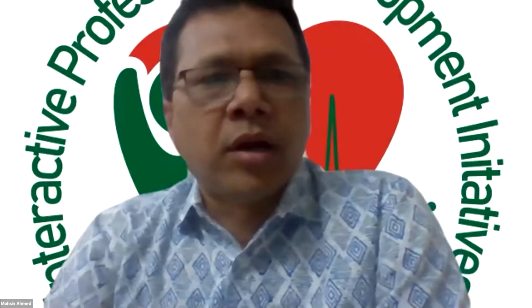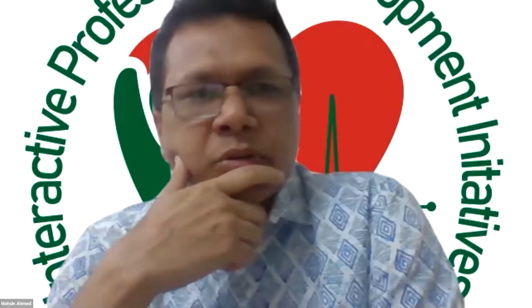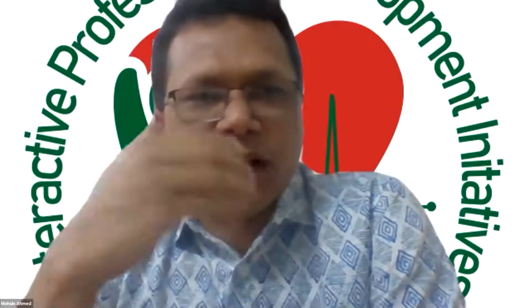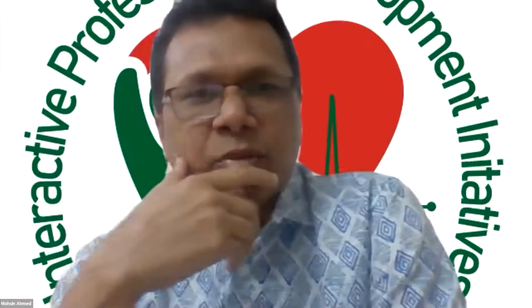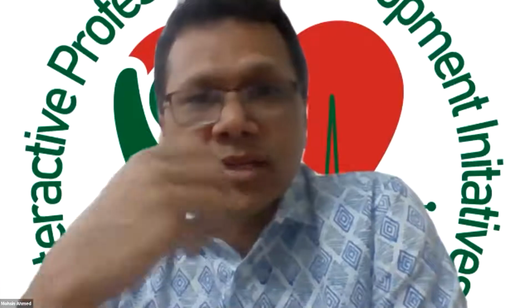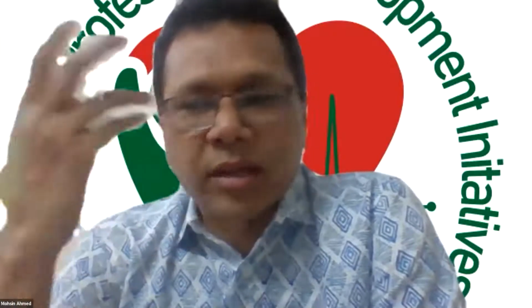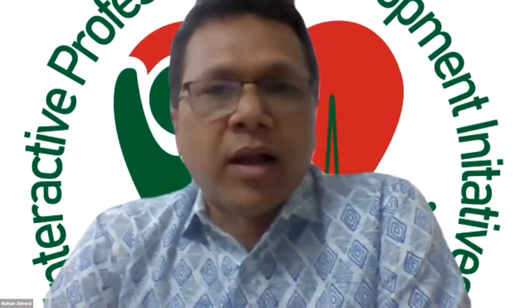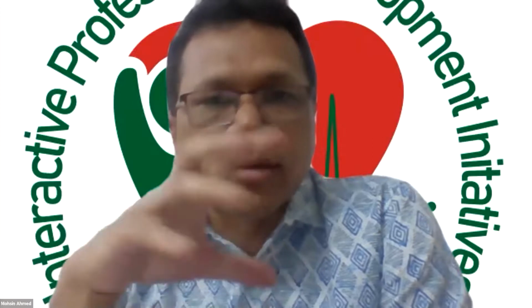Today's topic is Retrograde PCI. Two masters of CTO are with us: Dr. Kaisar Nasrullah, who is a master in Bangladesh, and whose passion is CTO and retrograde PCI. And another, from a previous lecture, Dr. Arun Kalyanasundaram. Welcome, Dr. Arun, to be here. He is also another master of CTO. Today's topic is designed entirely on retrograde PCI.